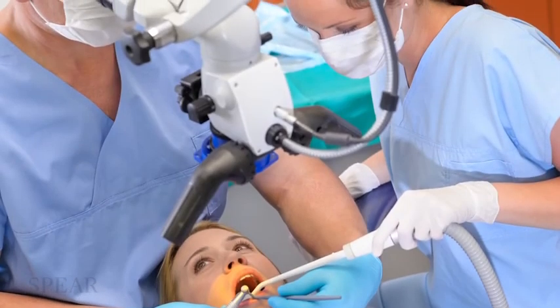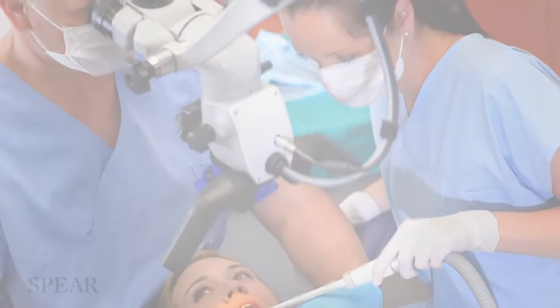And finally, the inspection of the tooth itself, because remember, we're checking out the pulp and the periapical area, but we're also checking the top of the tooth. And to do that, using your explorer and using high magnification and illumination is really helpful. In that situation, I think the surgical operating microscope has been just a lifesaver for me as an endodontist clinically, because I can see a lot of problems that are present even before we start.